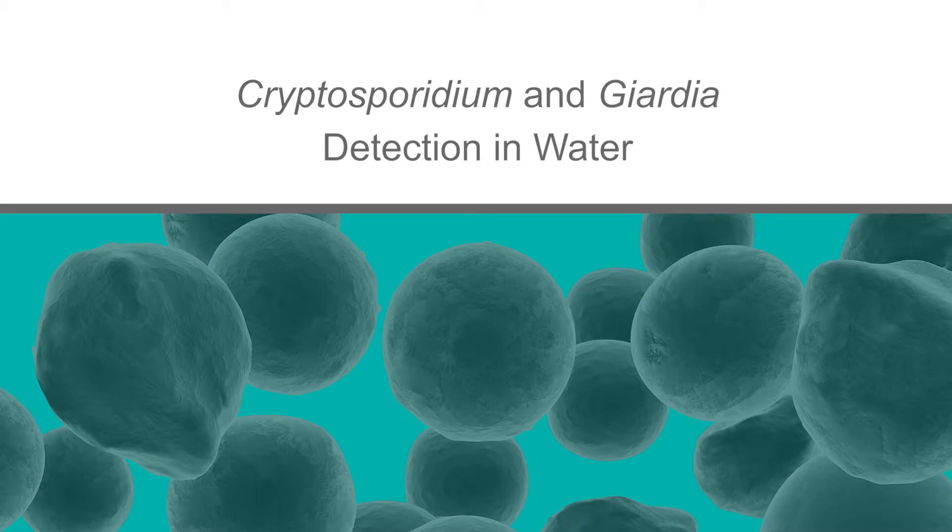In this series of videos we will demonstrate IDEX's optimized procedures for the isolation and identification of cryptosporidium oocysts and Giardia cysts.